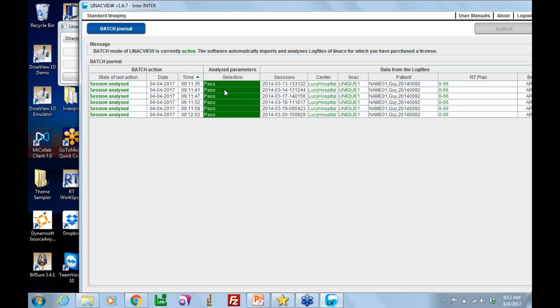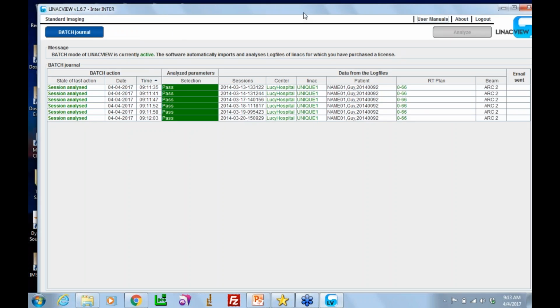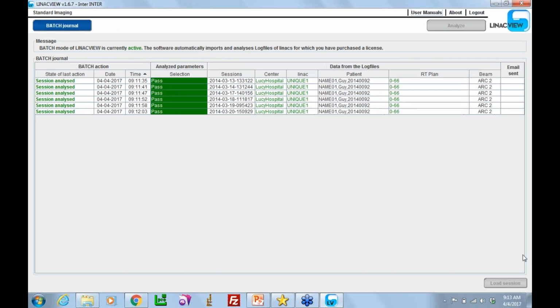As a physicist, there are other things that we monitor that are equally of interest to you, but they're just not of immediate interest to somebody treating. So, for instance, exact leaf positions might not be that important. And it turns out, and we all know this, that small errors in leaf positions and things like that don't dramatically change fluence maps.